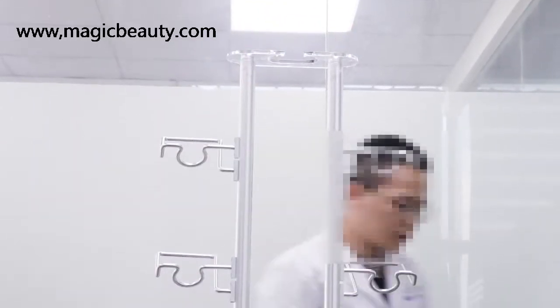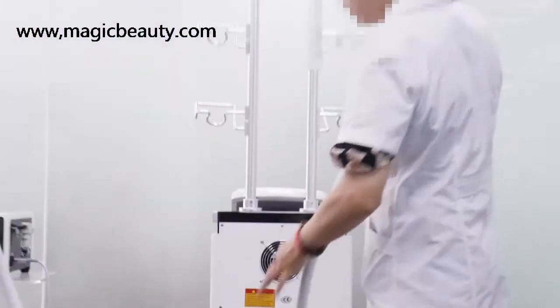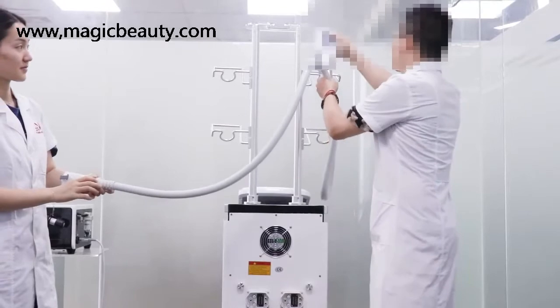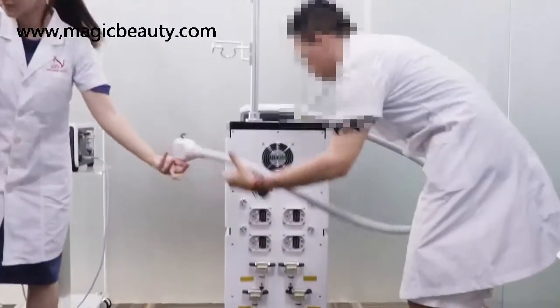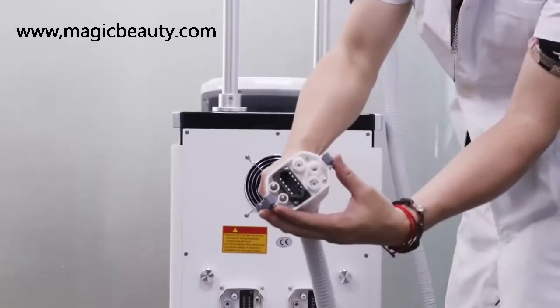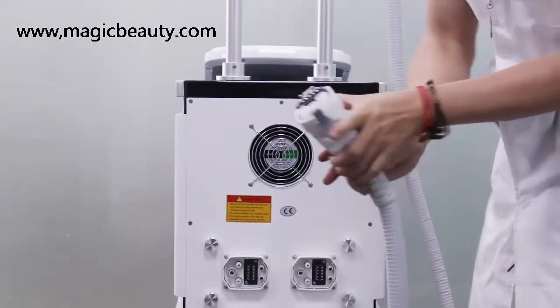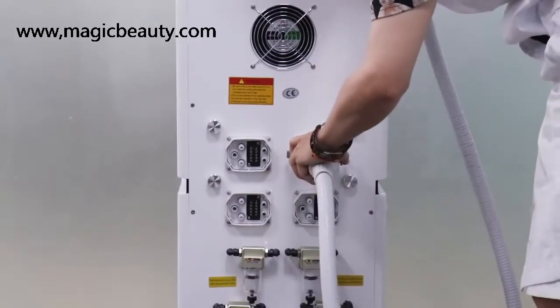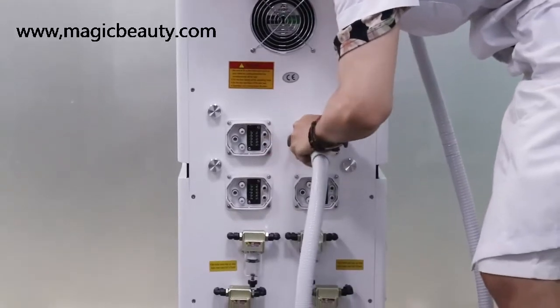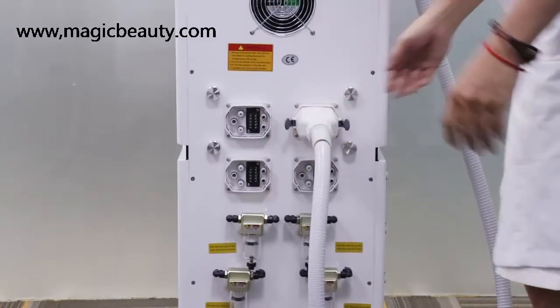After that, we can connect the handles one by one. First, put the handle on the holder, then connect and hold it one by one. You have to match each of the connecting pins to the machine, and press both sides. Push a little bit on both sides to connect it. The first handle is now fixed.